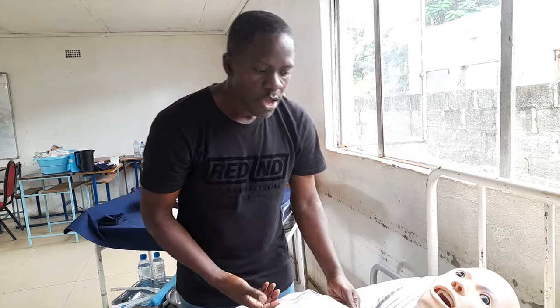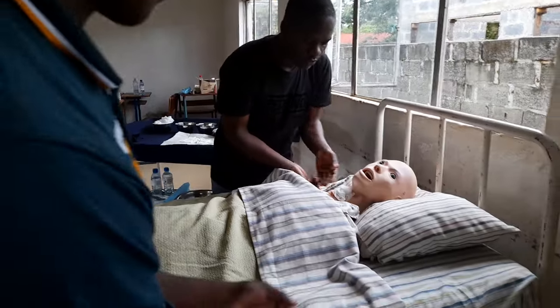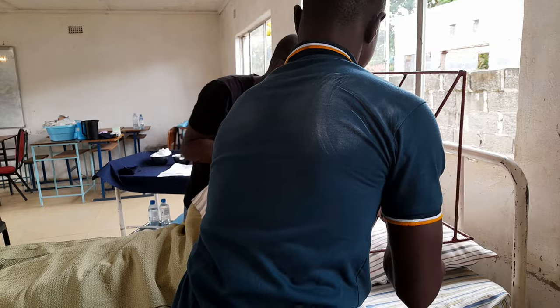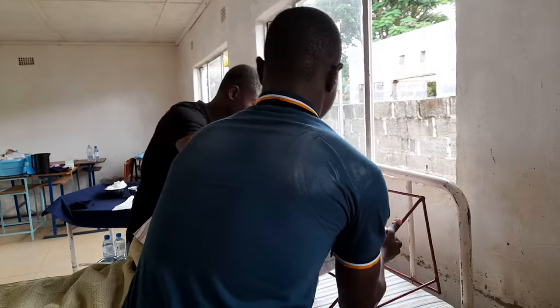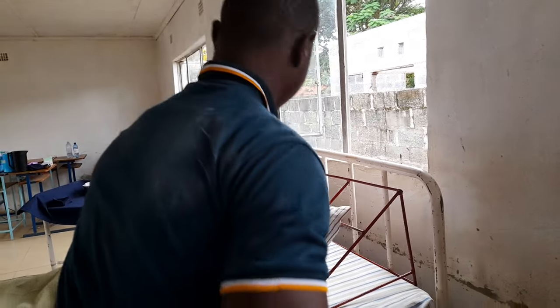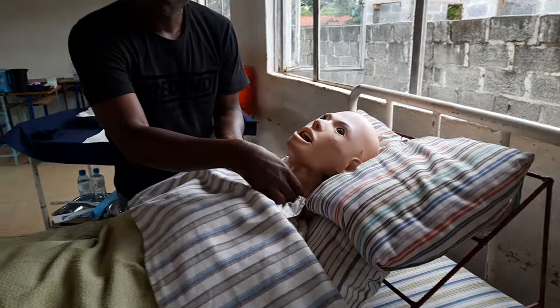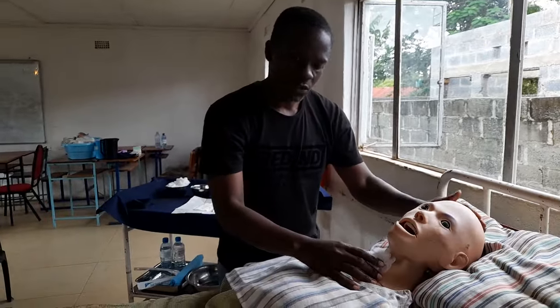You cannot suction while the patient is lying flat, so you need to position him at least 30 to 45 degrees. Ask your assistant to help elevate him with an extra pillow. Propping the patient up will earn you marks on the checklist. You should also assess the patient and ensure the area is not incontinent before moving on.